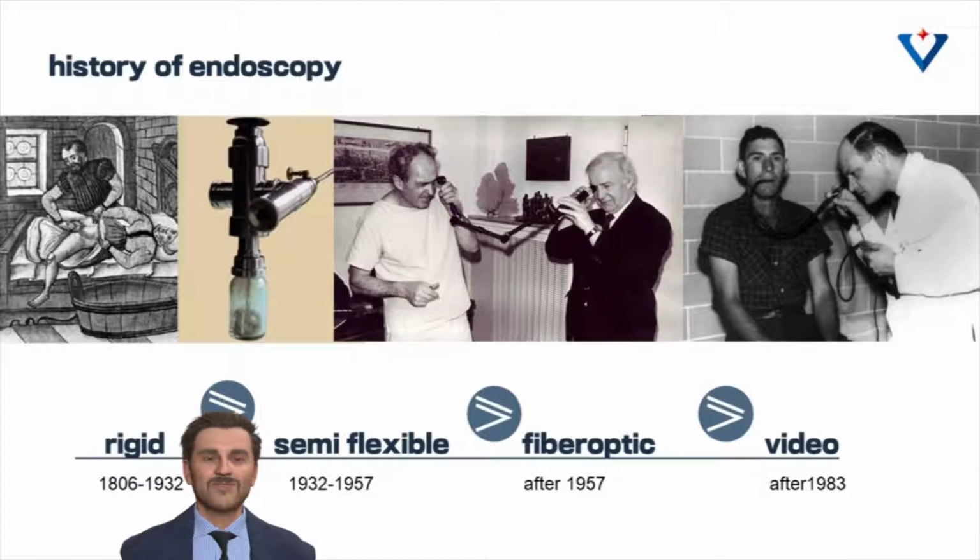In 1951, an optical physicist called Harold Hopkins was at a dinner party in London. He was talking to a gastroenterologist who was a little bit upset about the lack of finesse of the instruments. What he really wanted was an instrument that was flexible, had good optics, a good light source, and enabled the tip to be manipulated in many different directions. So Hopkins went away and thought about that, and he knew a little bit about the Renaissance Venetian glass blowers, and how they bent light around corners in glass, and he started experimenting with narrow tubes of glass. In 1954 he published his prototype in Nature, a flexible prototype of the modern endoscope.